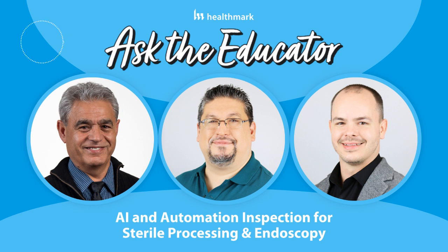But with devices such as endoscopes, which have cannulated lumens, you really need something more to find debris and check cleanliness inside the lumen and cannula of those devices. So the basic question is: is your device clean and ready to be sent for high-level disinfection or sterilization?